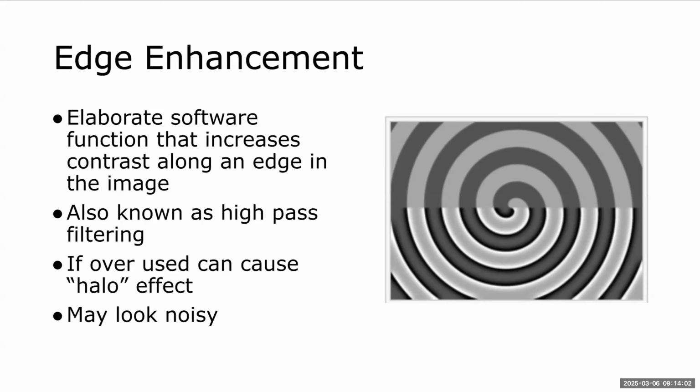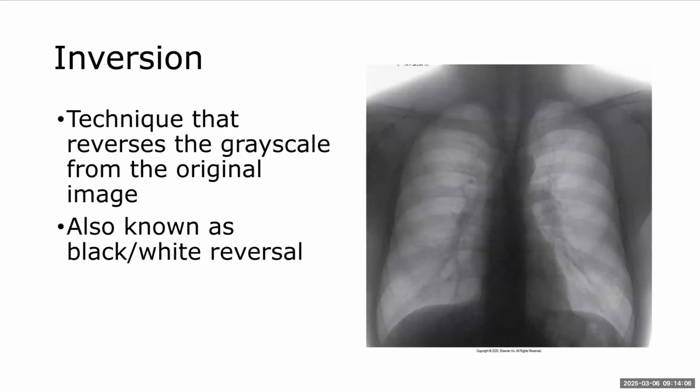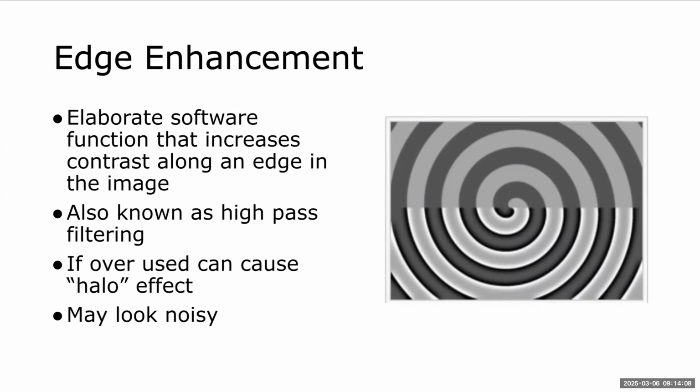If it's overused, it can cause what looks like a halo effect. I tried to narrow this down some because I couldn't possibly reteach everything that we learned in like 6 weeks in 2 hours. But anyway, it can create a halo effect in parts of the image. So you don't ever want to overuse these things.